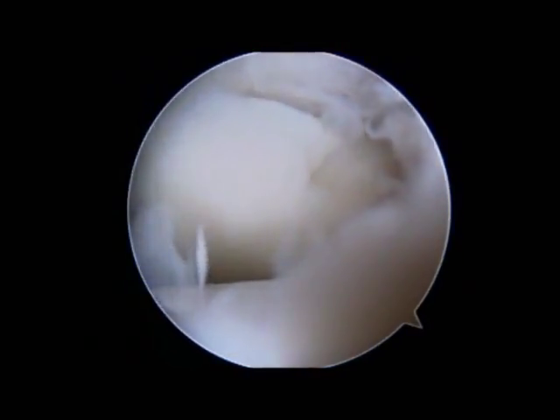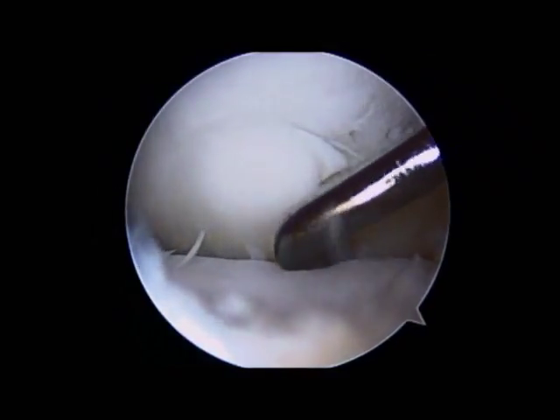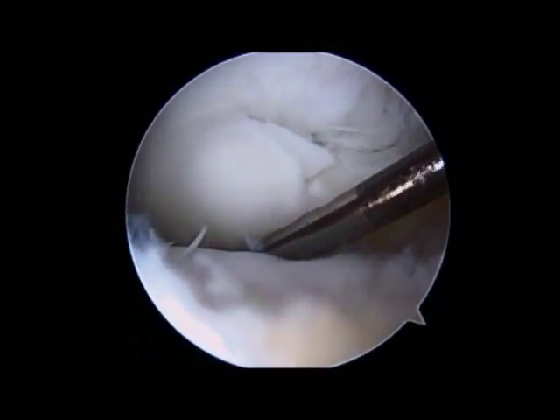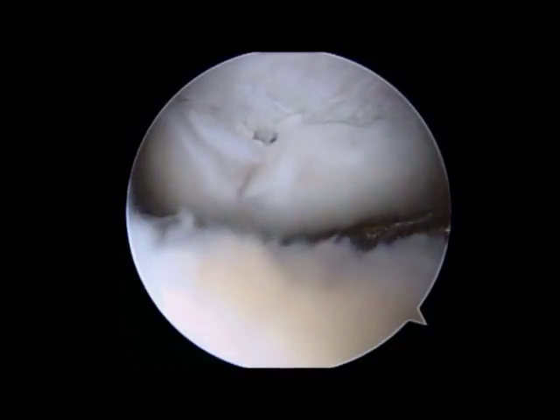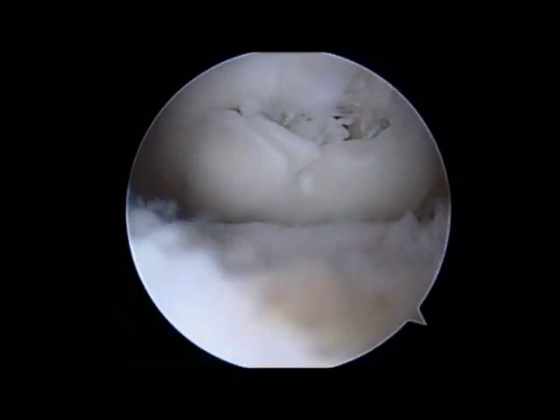You can see that the lesion looks to be somewhat unstable as the elbow is moved around, and a probe is brought into the joint to test how stable or unstable it is. You can see that it's quite unstable — these pieces are really just barely hanging on and have a great potential for separating and then becoming loose bodies themselves.